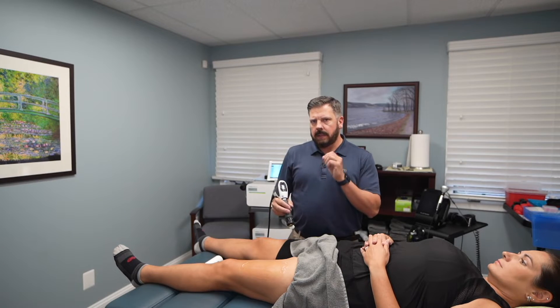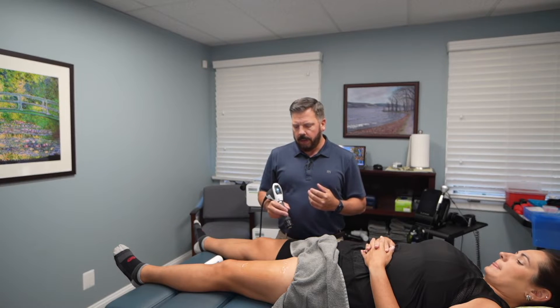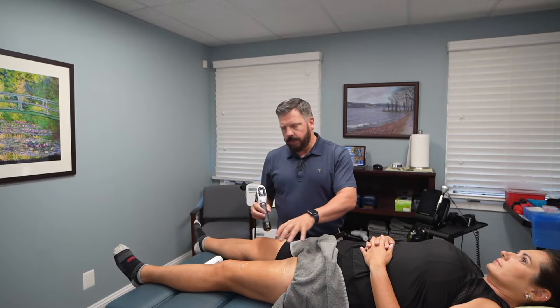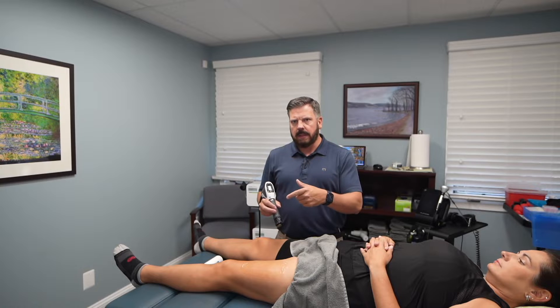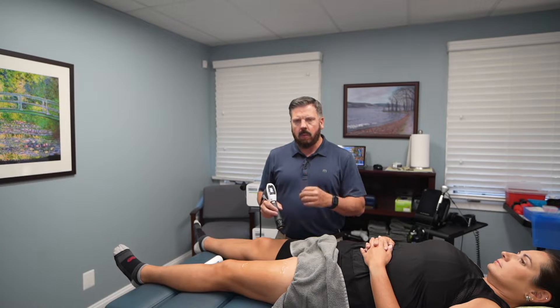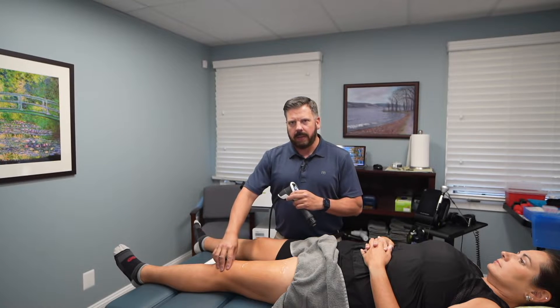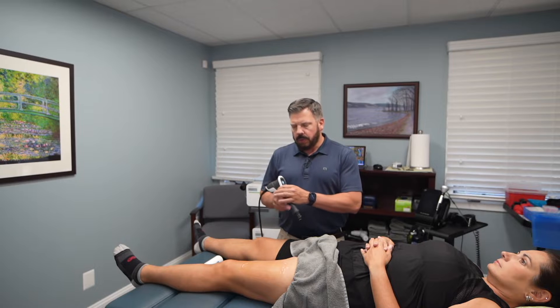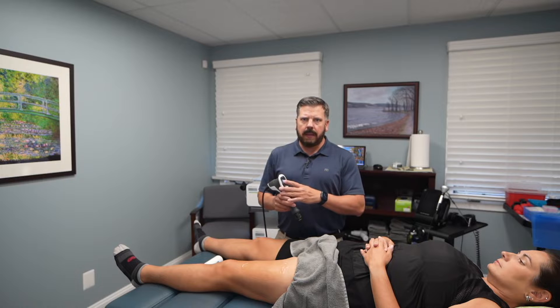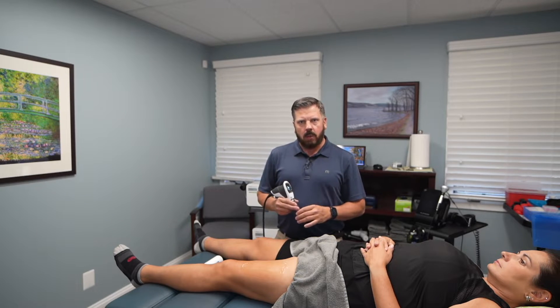You can hear how loud that is — that's the compressed air sending that projectile in and creating that force. This is great for a broader area, so we'll use this first, find any of those tender spots, and then specifically go in with the focus shockwave on that one spot. The limitation of this is you can't really use it over a bony area — it's not very comfortable and it's very superficial. If I wanted to get say 10 centimeters deep, I couldn't do that with this, and that's where I switch to the focus.